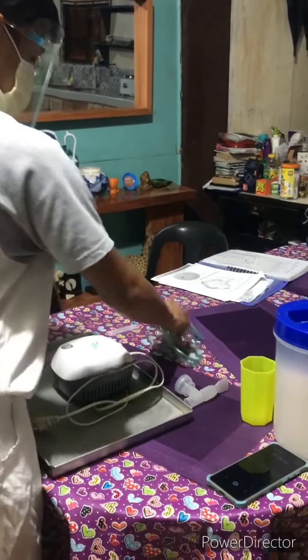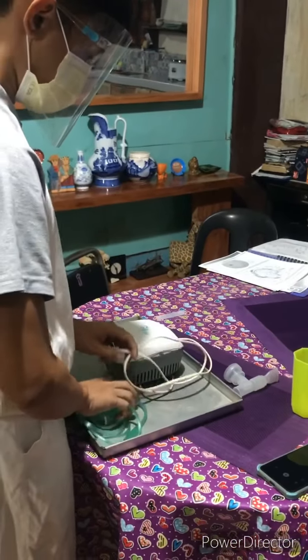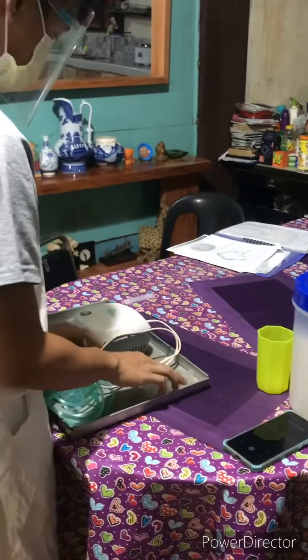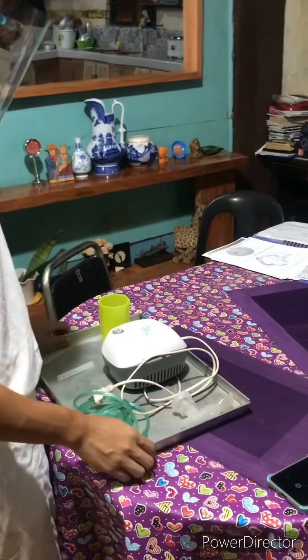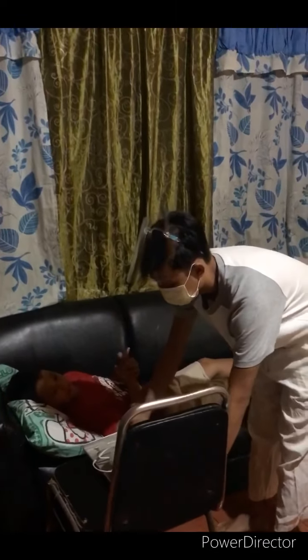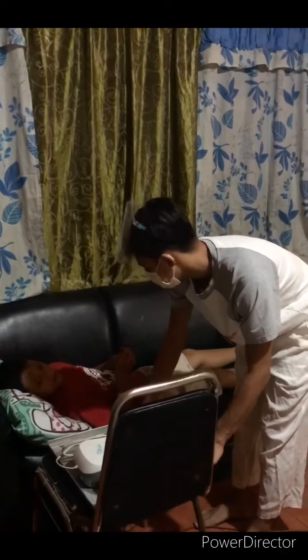Place the medication on a tray or move the medication cart outside of the patient's room, or prepare for administration in the medication area. Organization facilitates error-free administration and saves time.